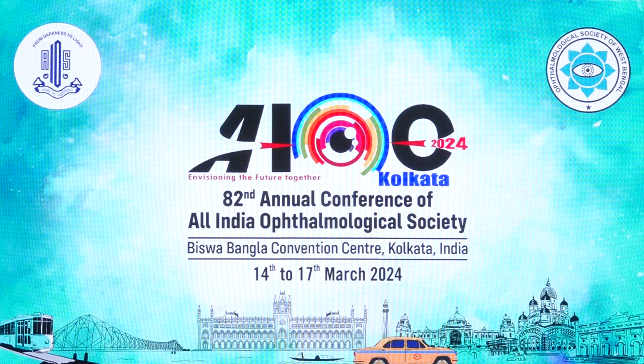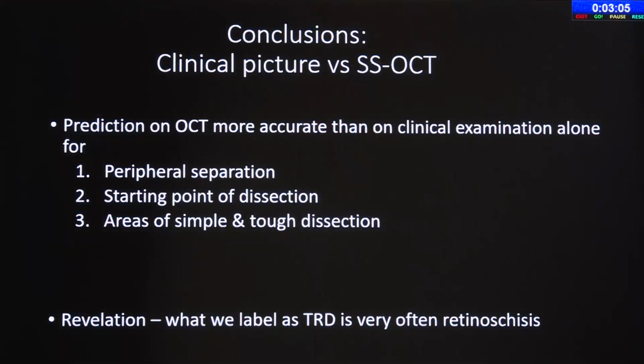I think it's always good to have information. It's like if you're going for a war, you have some intelligence before the war, you can always be more successful. Secondly, if you know that there's no plane or area, then you can start off with a bimanual surgery. Otherwise, you start and then it gets very messy, then you switch to bimanual. So I think it's always better if you are prepared, you know it's going to be tough, you know that the plane is not going to be there. Then from the beginning, you can get your best weapons out rather than in midway of a case, when you're in a messy situation and bleeding, then you switch to bimanual. So I think this is one way it can help us.